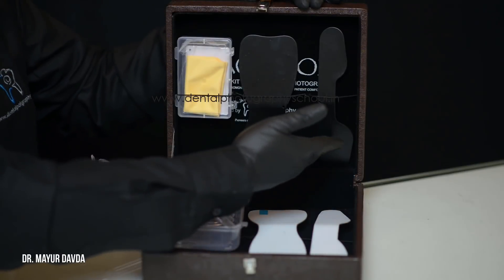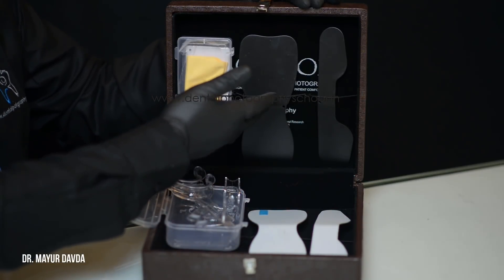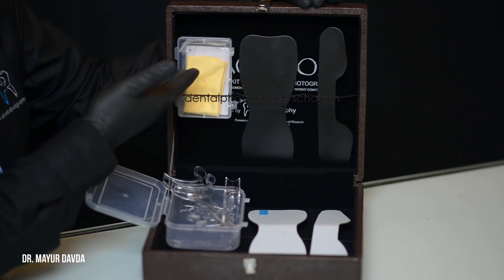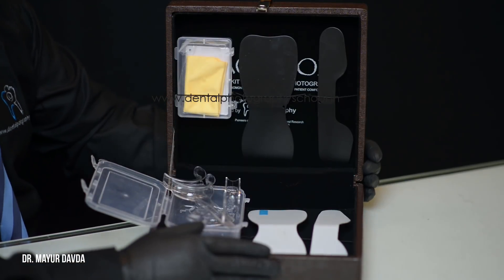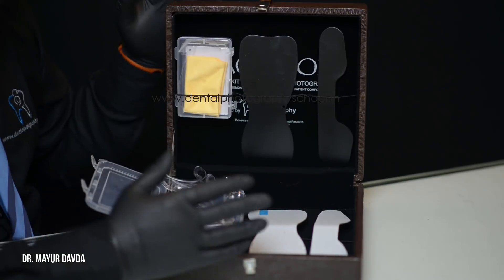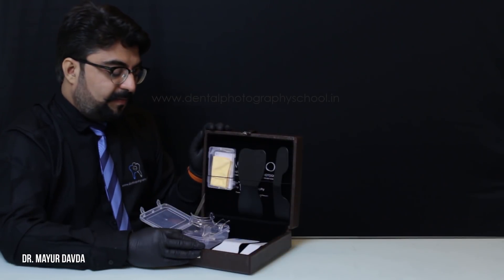We also have the sectional contrastors and then we have the full arch occlusal contrastors. We also have the grey card and a microfiber cloth. This is the complete requirement of intraoral accessories that each and every dentist or dental clinic must have in their clinical practice.